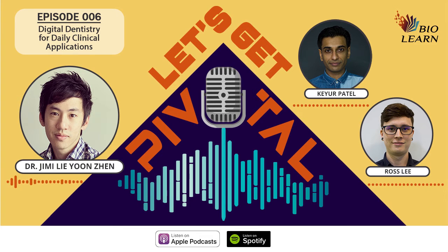I did some 3D design on Meshmixer, and after I printed it out with the FDM printer, I converted it into a stone model because an FDM printer can't withstand the temperature of the suck down. So I had to convert it to a stone model first before I did a suck down, and then I trimmed a tray, and then I got one aligner. So you actually went the reverse way, from digital to analog. It's digital, analog, and digital again.